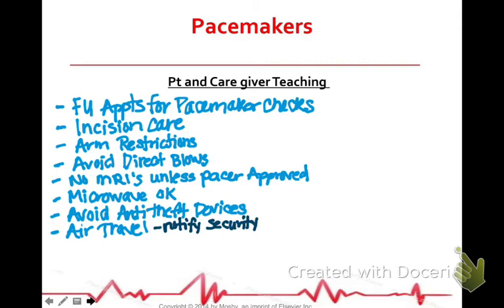A microwave oven's okay to use. Avoid anti-theft devices, which means you can still walk through them, you just don't want to stand in front of them, like at Walmart or CVS, just because it can mess with the electrical current. You just don't want to hang around.